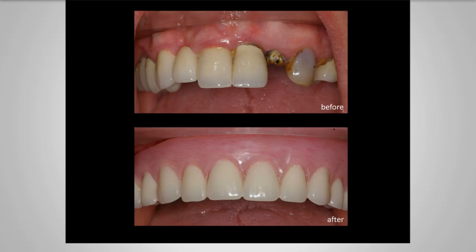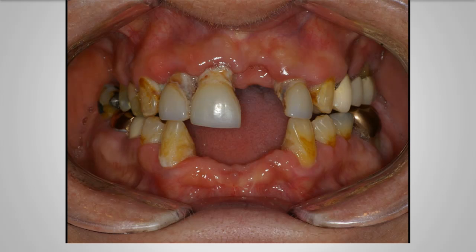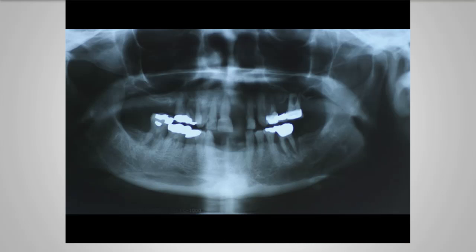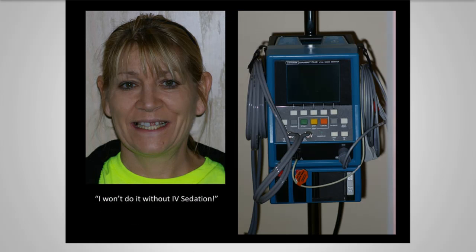And so we'll go ahead and relieve any excess flash, as you can see. Another thing I'll do is I'll coat Vaseline in these areas so that the material doesn't lock on, so when I trim it, it just pops right off.